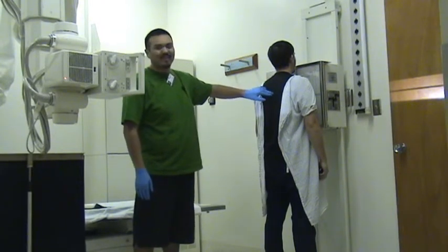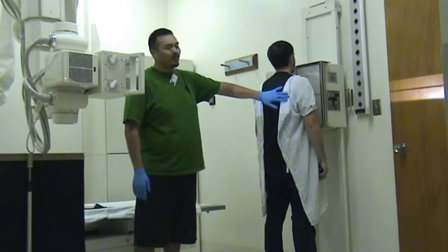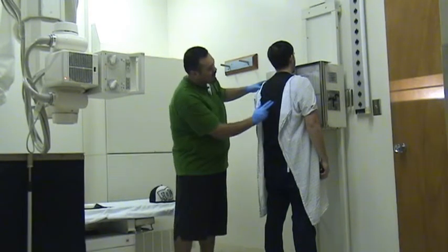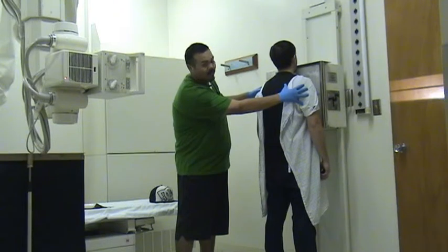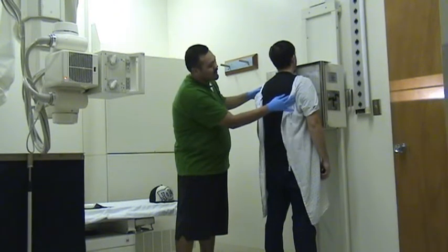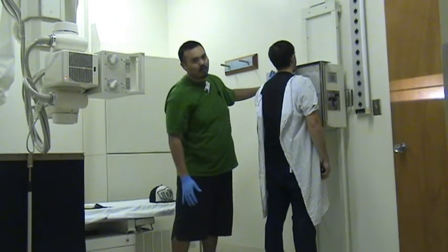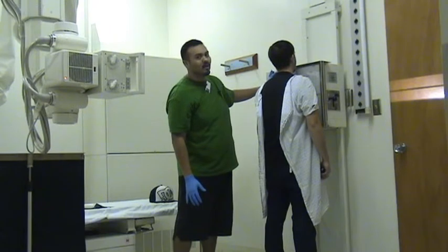Make sure you center your ray at T7, which would be roughly at the bottom of the scapulas. You want to follow your center line down the mid-sagittal plane, bottom of the T7, and patient center right here. You want to make sure you give yourself a little bit of room on the shoulders. Make sure you include all the anatomy.